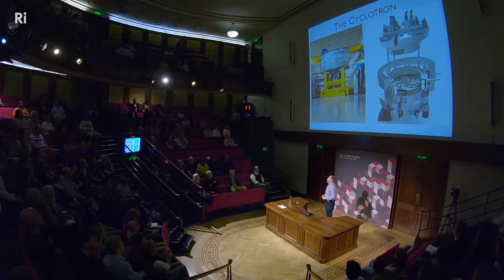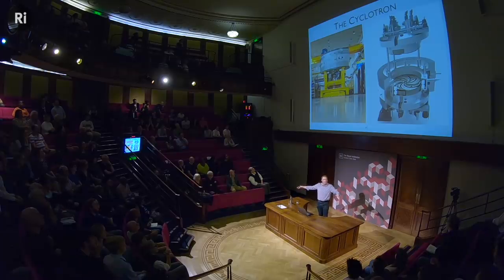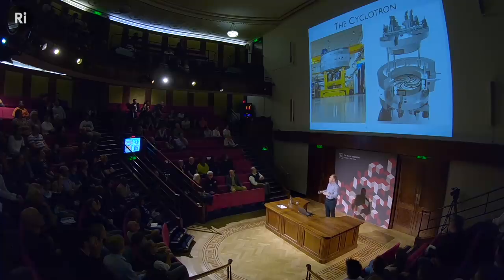This is what the particle accelerator looks like. Now, that cyclotron is about 2.5 meters across, so not much different from the size of this desk. So much more compact than the technology that I've been showing you. The big part is not the accelerator, and the hard part is not the accelerator. It's not difficult to get protons up to the right energy. It's difficult to get them where you want them to go. It's the gantry. It's delivering them to the patient.